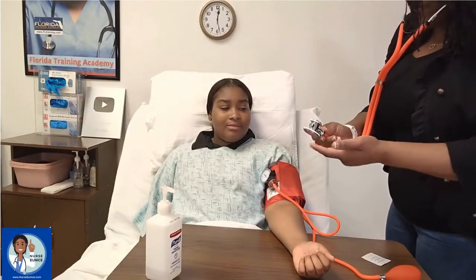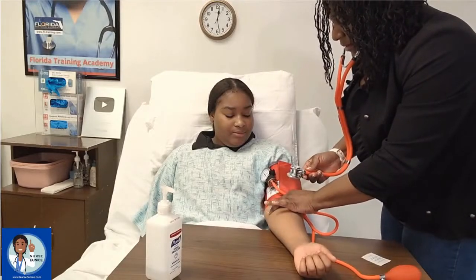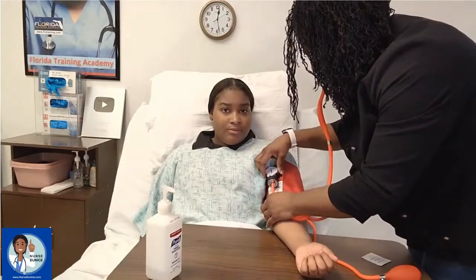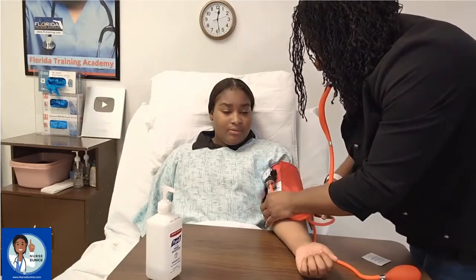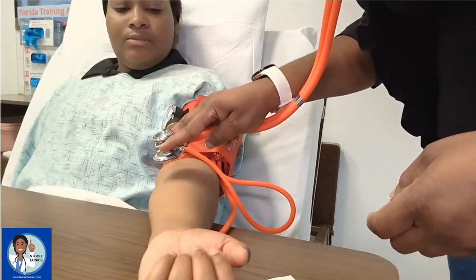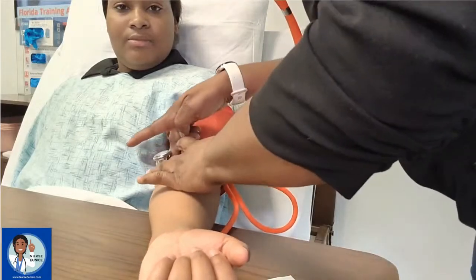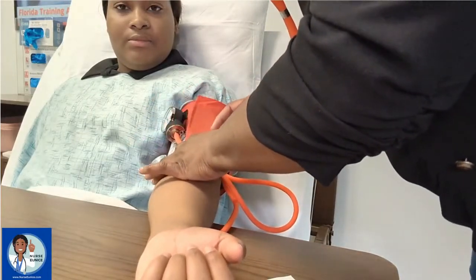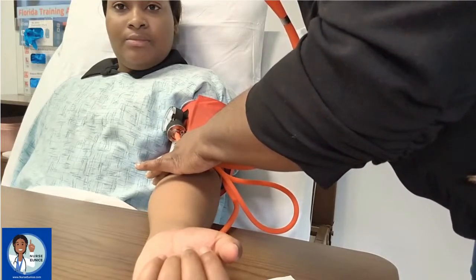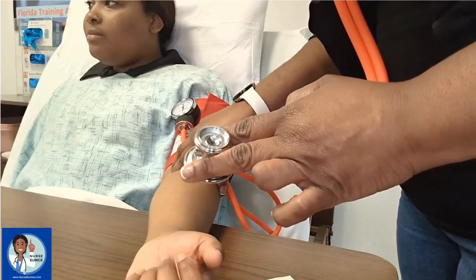Now we're going to place the diaphragm of the stethoscope on top of the brachial artery. Make sure your tubing is not hitting the stethoscope. We're going to place the stethoscope on top of the brachial artery like so. When holding your stethoscope, try to keep your hands off the tubing — otherwise you're going to have additional background sounds.